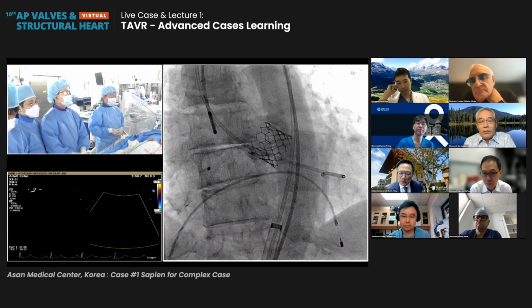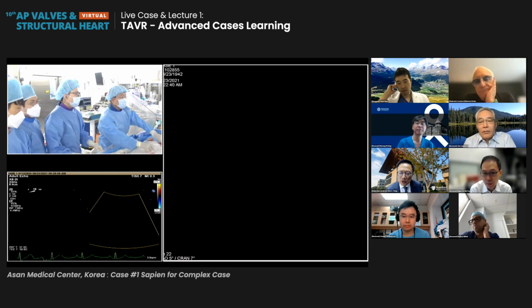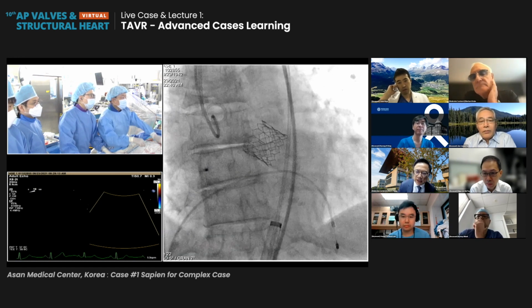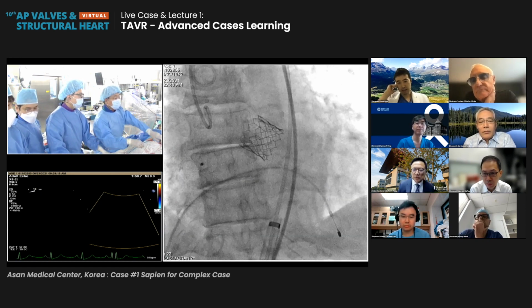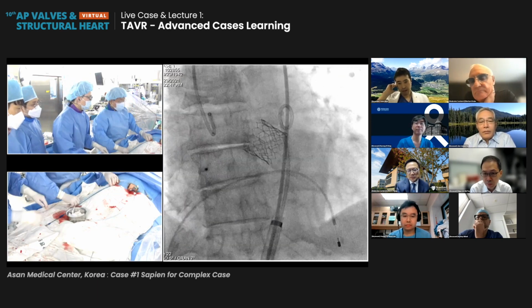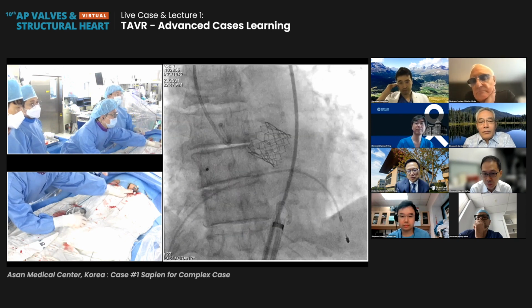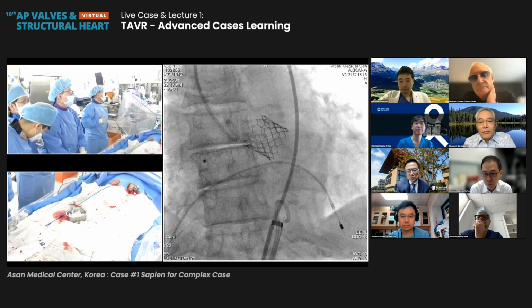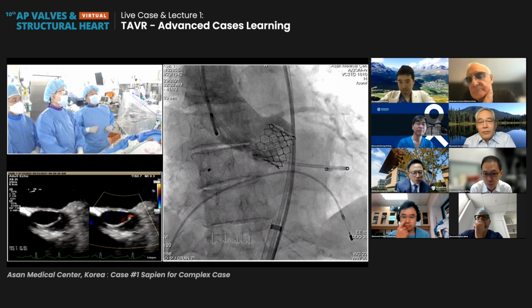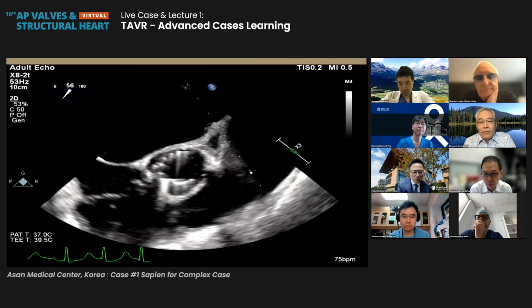Well, still some AR. However, I didn't do any more procedures. Just take the pigtail out at this point and just check. Yeah. Exactly. Wire. All right, good. Check it again. All right, echo. All right, monitoring first. One more. Okay. Professor Lee. No pigtail cut. Stay in LV on Confida.